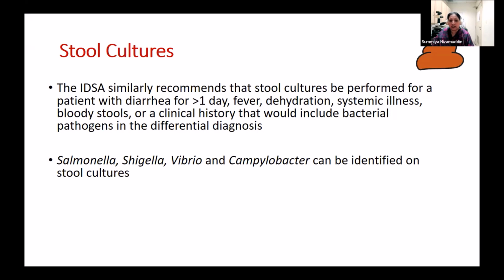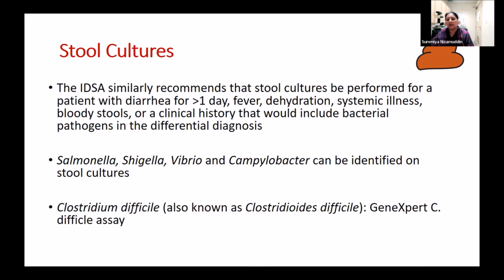ये याद रखें कि इसके अलावा जो रूटीन में आपको लैब, a routine microbiology lab will not be able to identify any further causes of bacterial diarrhea. Other causes, but if you are, for example, suspecting parasitic causes, उसके लिए फिर आपको separately sample for stool analysis भिजवाना पड़ेगा. Okay, so then we will be able to identify, for example, Giardia or Amoeba, and those would be analyzed on stool microscopy.